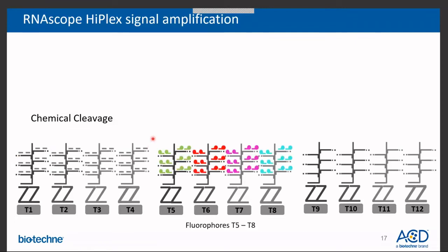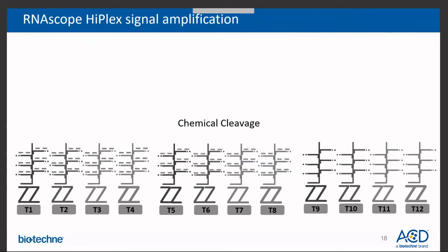Because you're going to come along with your next set of tagged fluorophores, it's the same colors, but now they're tagged differently, such that they will land on trees T5, T6, T7, and T8, respectively. You cover slip and then take another image. You then repeat this process again.